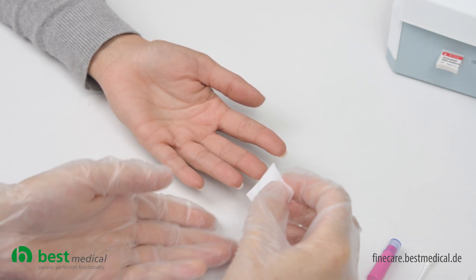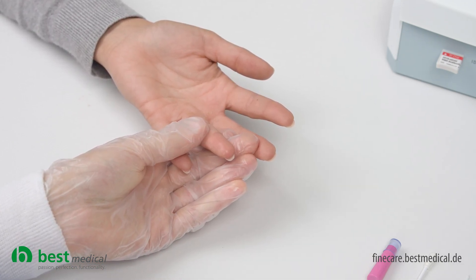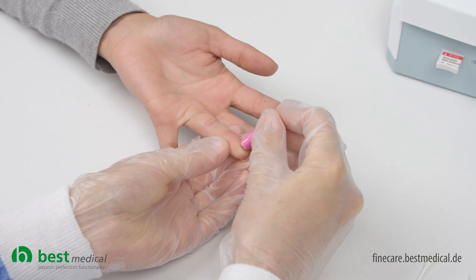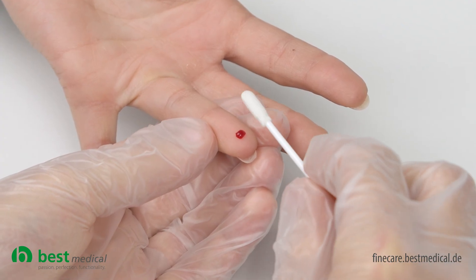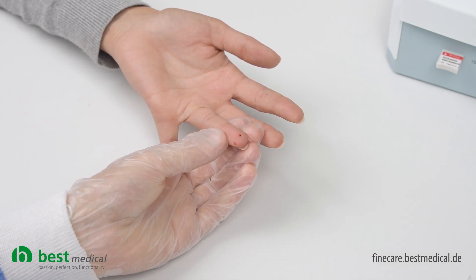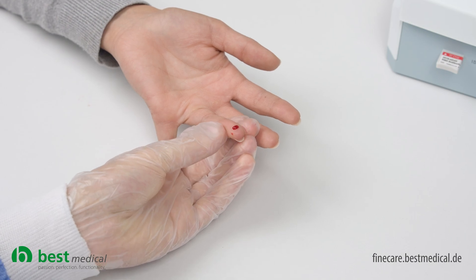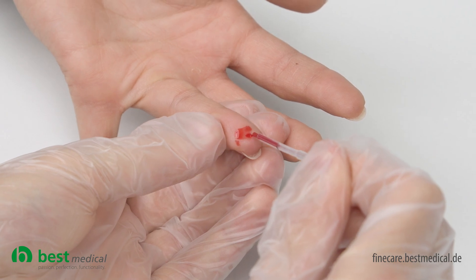Before taking the blood sample, first clean the fingertip with the enclosed disinfectant wipe. Then puncture the fingertip with the sterile lancet. Remove the first drop of blood — this should not be used for the test. Then take 20 microliters of blood with the capillary pipette. Pay attention to the marking on the pipette.